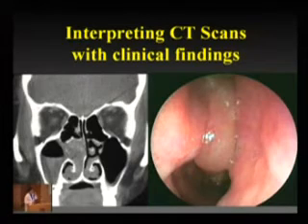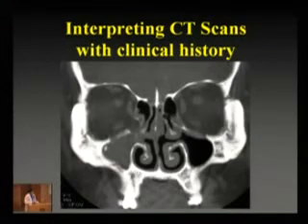And that is the advantage we have as clinicians: apart from the history we get from the patient, we are actually able to examine the patient and interpret the CT scans with that additional information. And we also get the history, as I said.